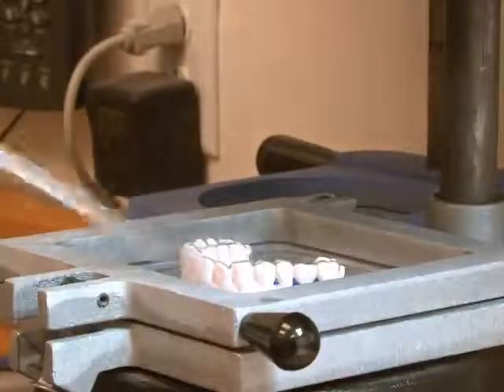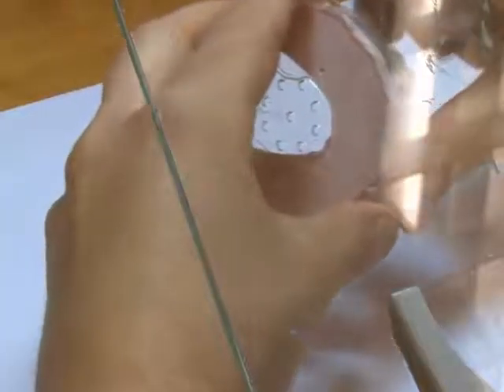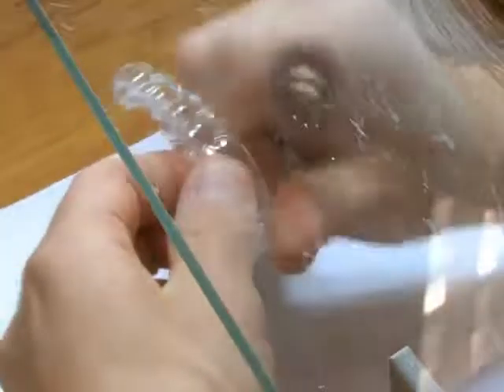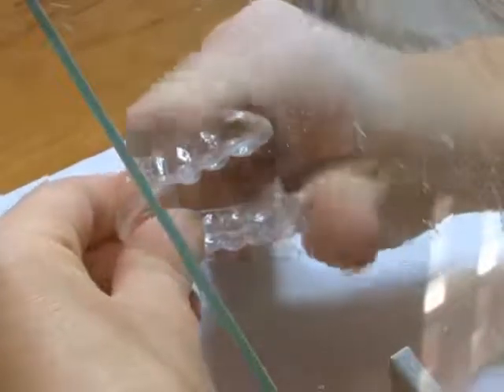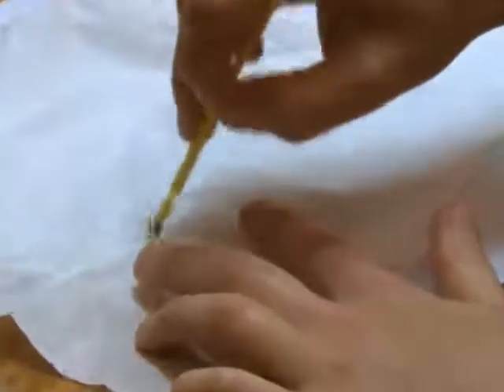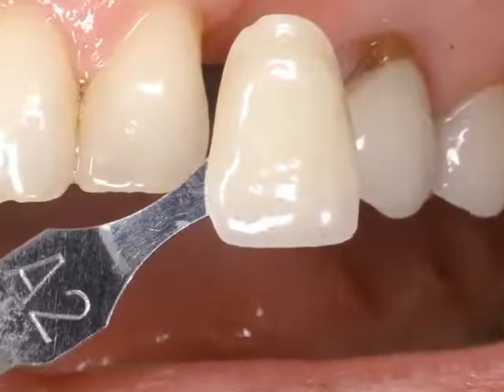vacuform machine to have a suck down matrix, and we're going to use the 035 material, which allows us to get very, very nice adaptation and good fit and excellent aesthetics for a tooth replacement. This is then trimmed in the lab. Different tips can be utilized. All these tips are made available through the Dentsply Raintree division, and these then allow us to remove any of the sharp edges of the vacuform matrix.